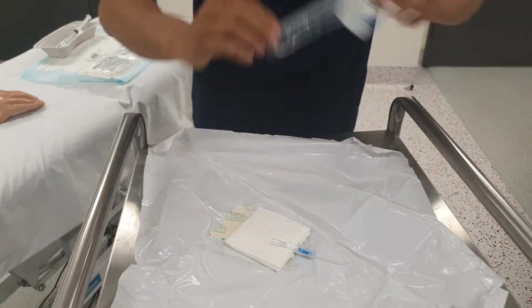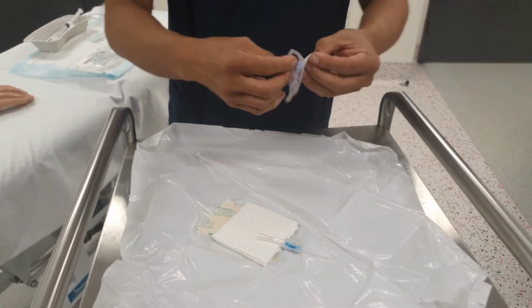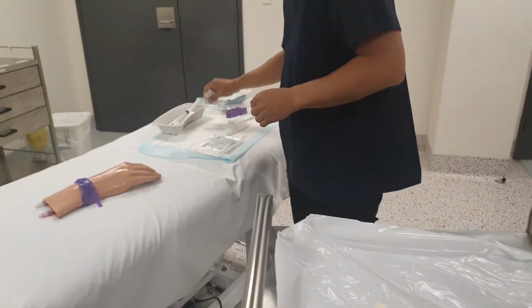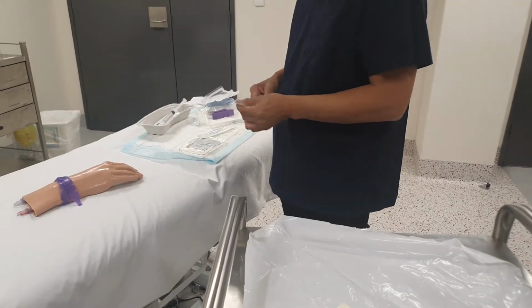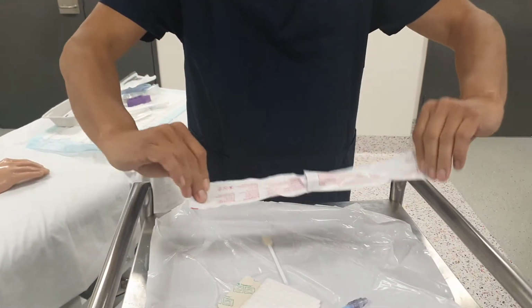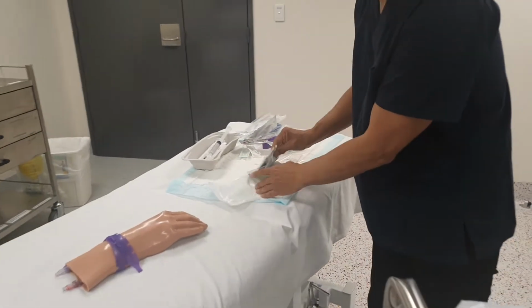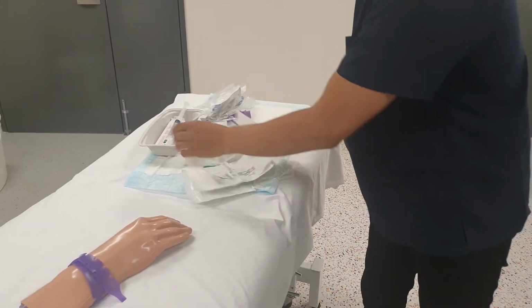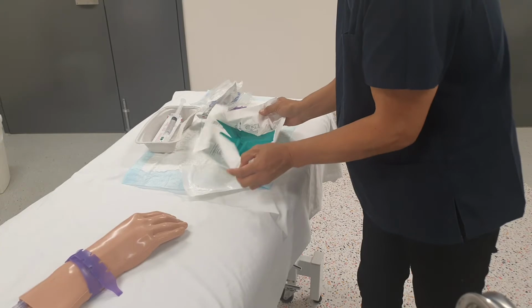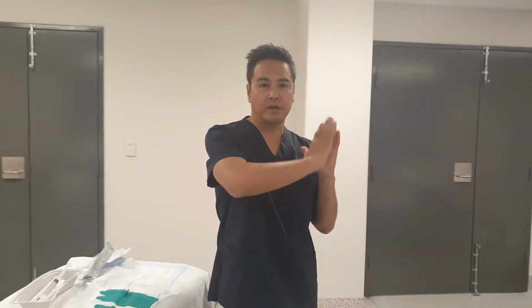I'm going to put my cannula in there. I'll put my cannula cap in there as well. This is my chlorhexidine swabs, my lollipop that I can clean the area with, and this is my sterile gloves. I'll open up my sterile gloves away from the patient. So I'm close to being ready for the procedure, so I'll go off and do a hand wash, okay? 3-minute hand wash or whatever the correct policy is in the area that you're working in.